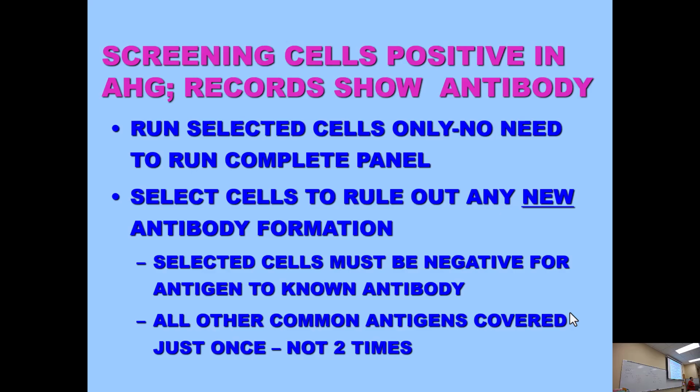Are we solely relying on the records that say there's an E? This is how we're ruling everything else out. Yes. If we have a history of E, we know it's an E. Trust it? Okay. So we just say, yep, we're definitely not giving any E positive blood.